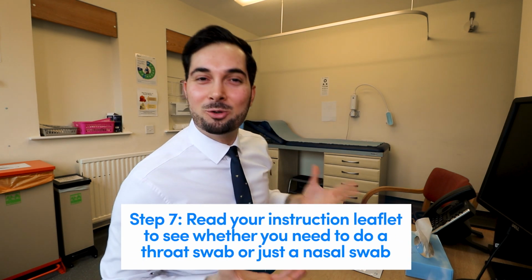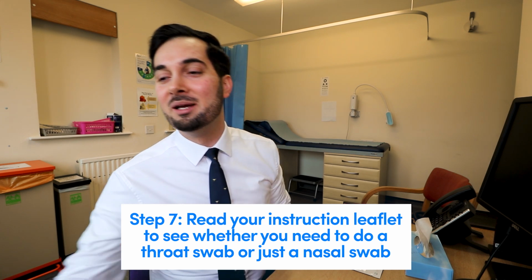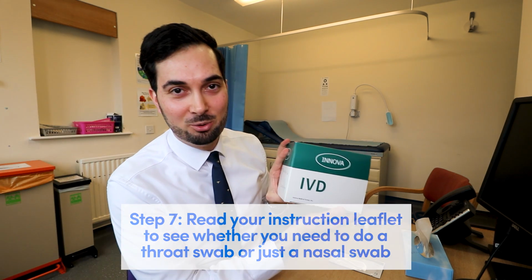So moving on to step number 7, this is where it starts to become a little tricky, because different testing kits have different instructions. So the IVD Innova one, which I'm going to show you again, the box that I've got, the information leaflet states that you only need to do the nasal swab, so you need to swab in both nostrils, okay? But other testing kits require you to do a throat swab and a nasal swab. So please, please, please read that information leaflet so you know that you're doing the right thing for your testing kit, so that you're getting the correct results.